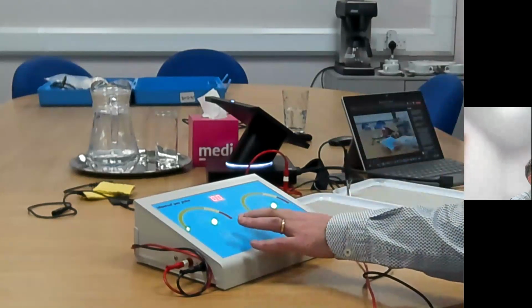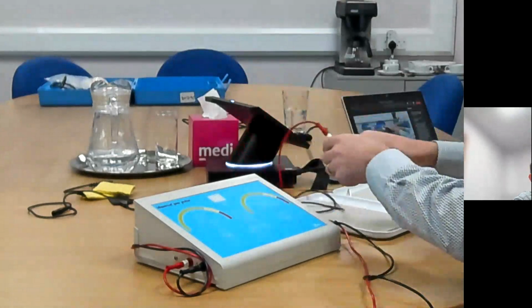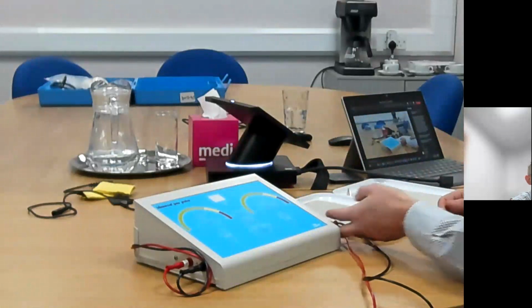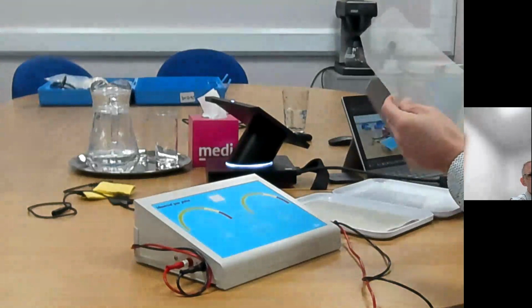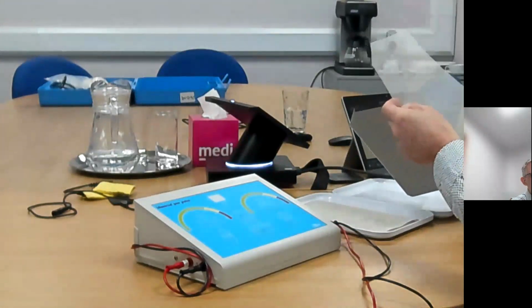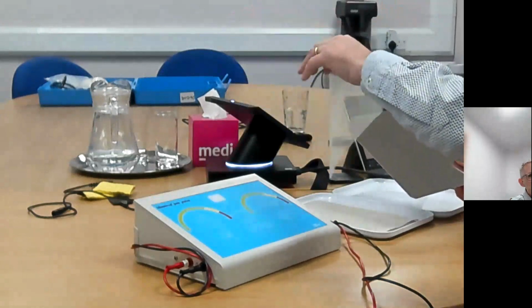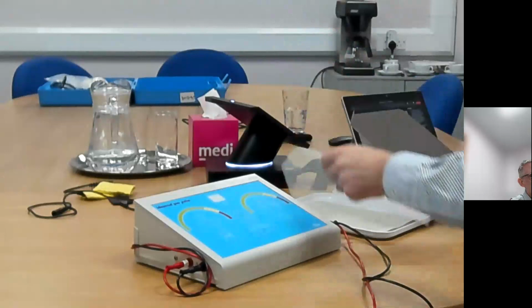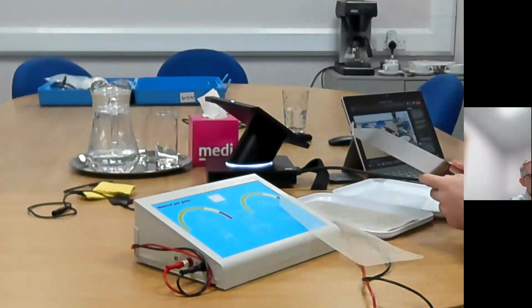Once you finish with the device, obviously switch it off, take the clips off, fold up the cables. You want to dry off the electrodes and the grills. Grills take a bit more drying, so they need to be air dried, and people often stick them near a heat source or a radiator for them to dry. The electrodes can be wiped down and need to be dry before you put them away.